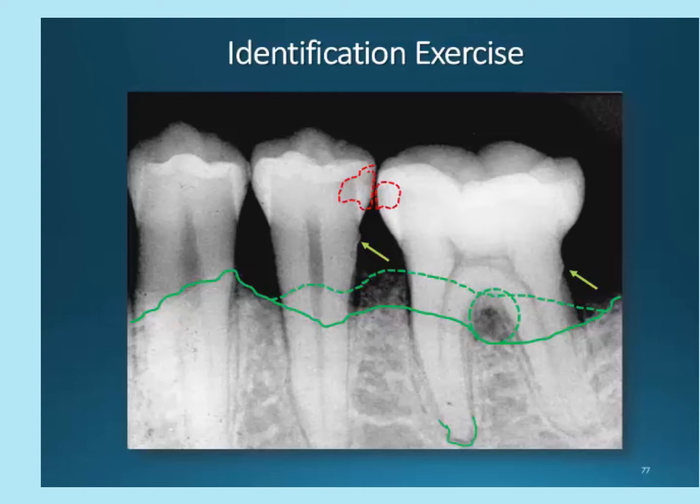We discuss severity and the percentage to make a general diagnosis, but when we do not have 30% or more of an affected area in the mouth, we can still identify an area as localized that is more involved. The furcation is very obvious in this film, and the main concern for the condition may be a classification of 4. This would be a localized classification and not a generalized classification. This is somewhat confusing, but we will learn more about classifications in advanced clinical procedures.